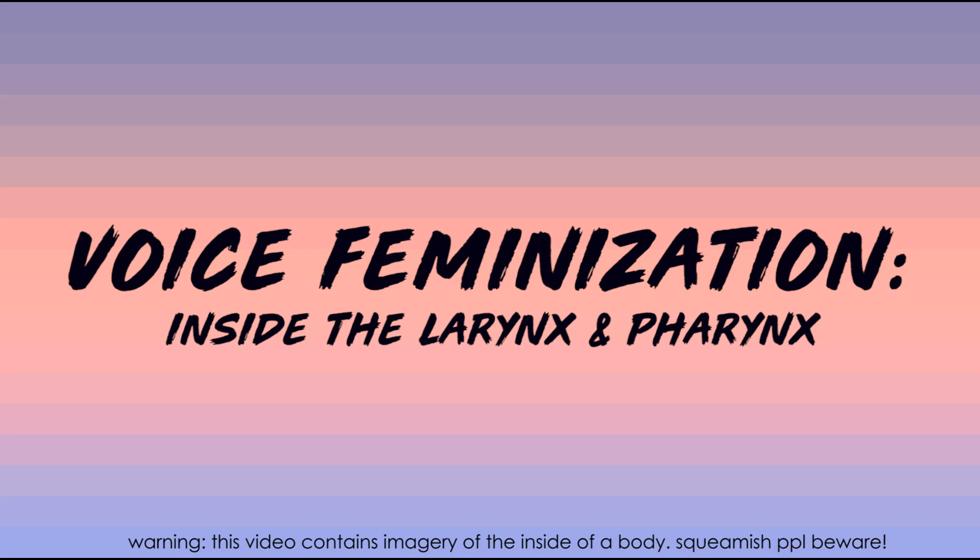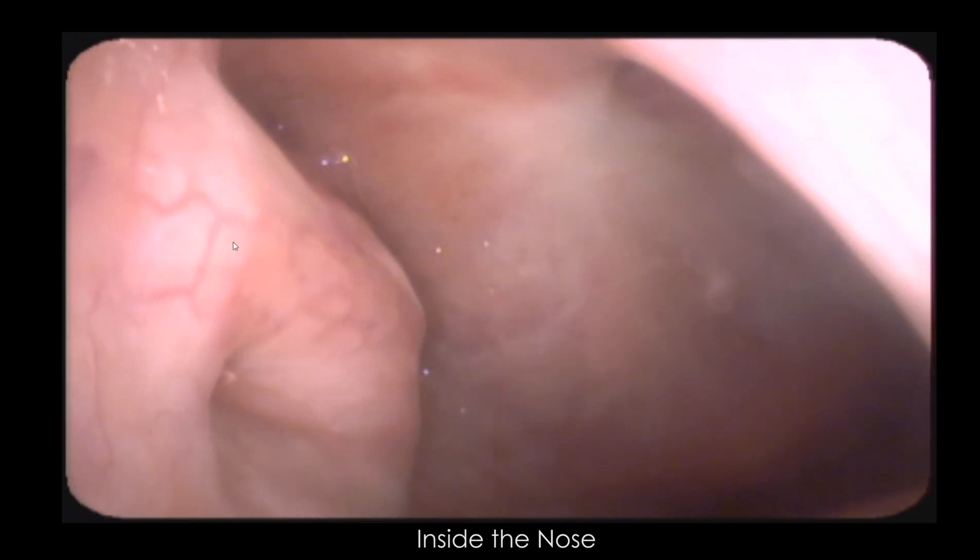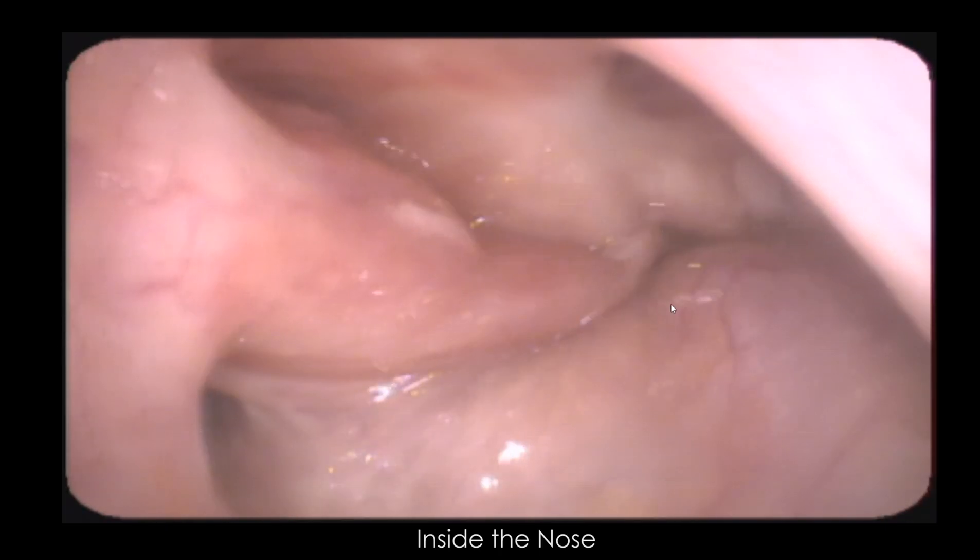Recently I got a laryngoscopy done on me — they stick a camera up your nose and then lower it down the back of your nose into your pharynx, and then we can look at the vocal folds and all the surrounding structures. So let's take a look. First off, we're inside my nose right here.